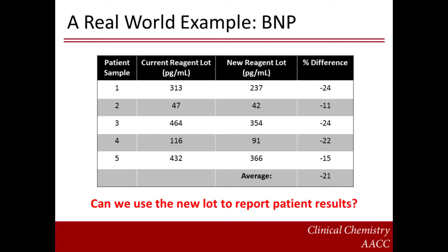I'd like to begin this pearl with a real-world example. BNP is a small peptide hormone that is used in the diagnosis of congestive heart failure. One of my laboratories received a new lot of reagent for this assay and decided to further evaluate it after noticing a large shift in the quality control results. The table here shows the results obtained for five patient samples using the current reagent lot and the new reagent lot. As you can see, the differences are quite striking. Should the laboratory accept the new lot and use it for patient testing?